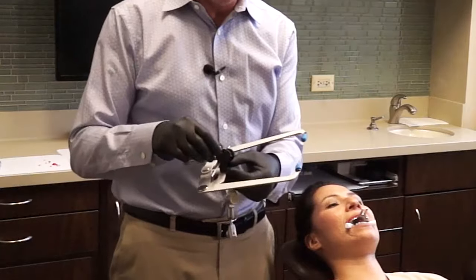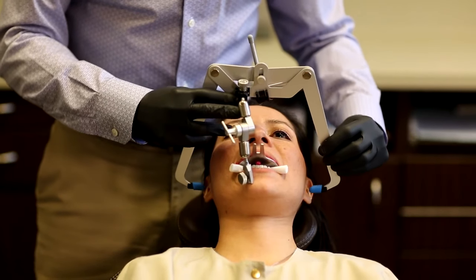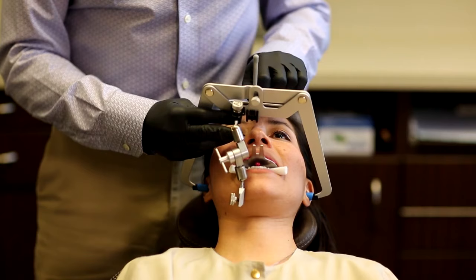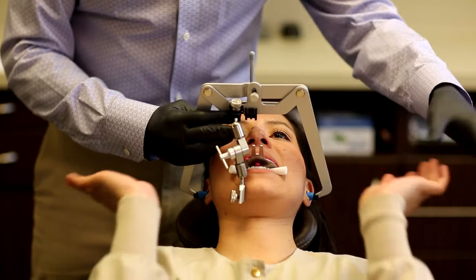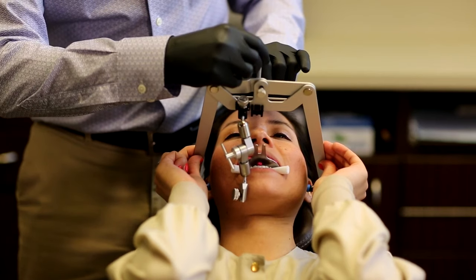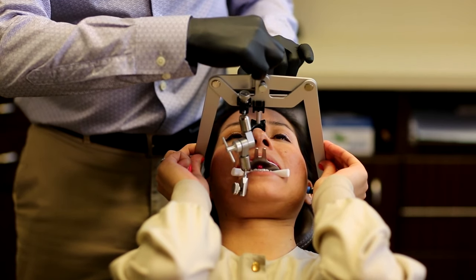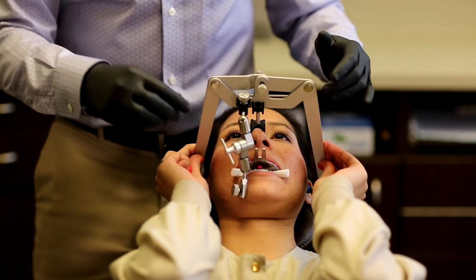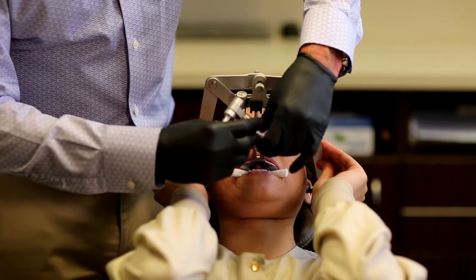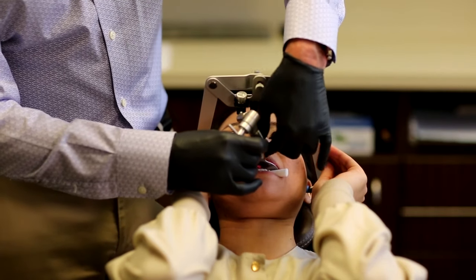I take the ear bow and slide it so it goes into Erica's ears, using the Nason to support it along the bridge of the nose. I ask Erica to use her hands to support the ear bow as we slide it into her ears. I loosen the Nason so it can support the ear bow properly, then connect the ear bow mounting jig to the mounting plate — it slides right on to the mounting plate and is held in place with a single screw.